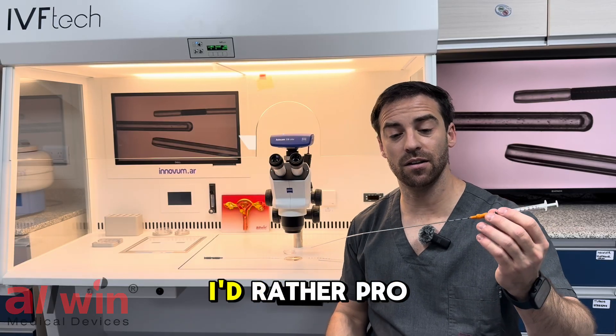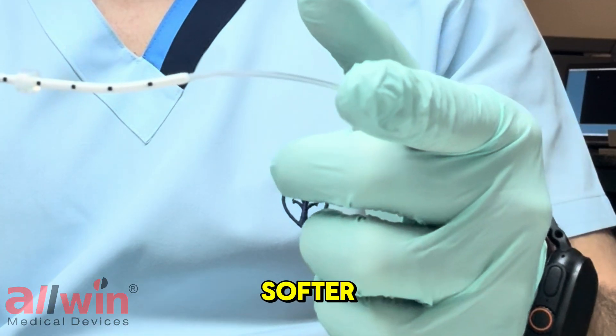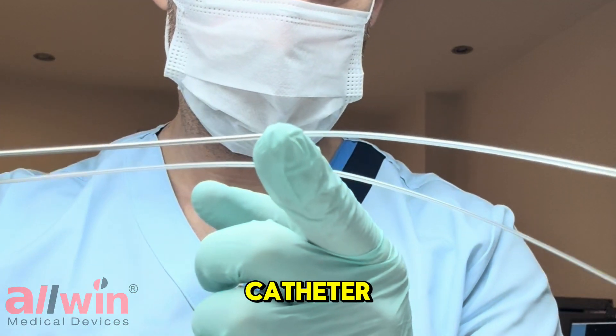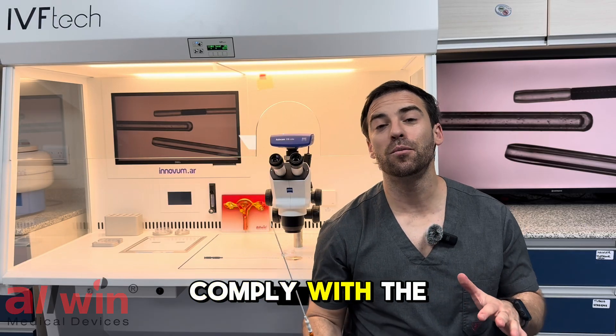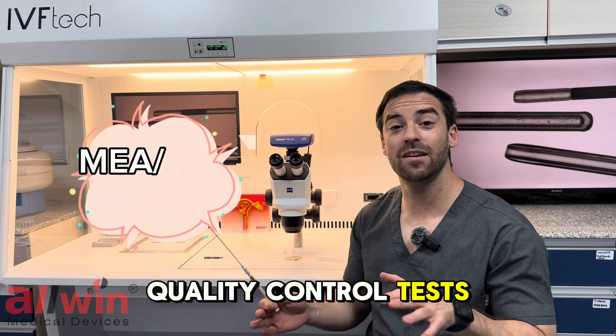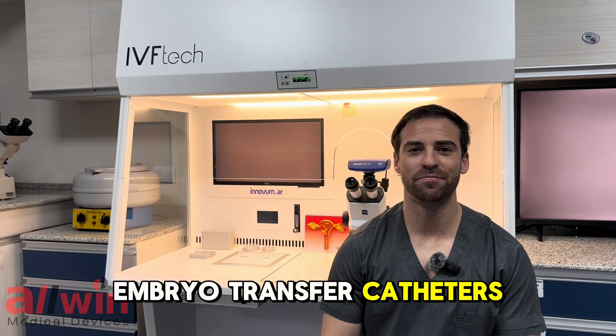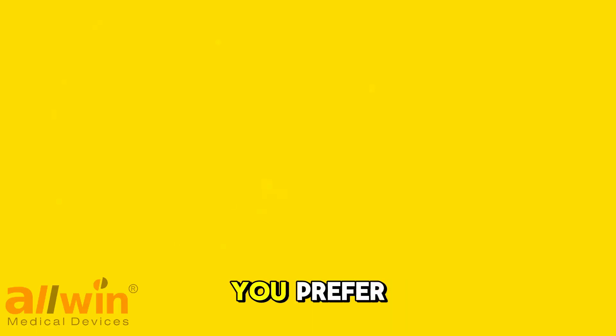You can choose either option. I'd prefer the Pro-Ecotrans because it's softer, but it also has a steel pipe to support the inner catheter. Of course, they both comply with the most rigorous quality control tests and embryo toxicity assays. That's all about embryo transfer catheters — let me know in the comments which one you would prefer.